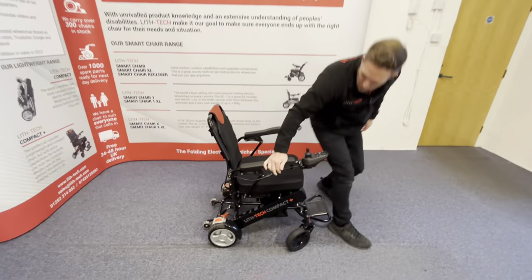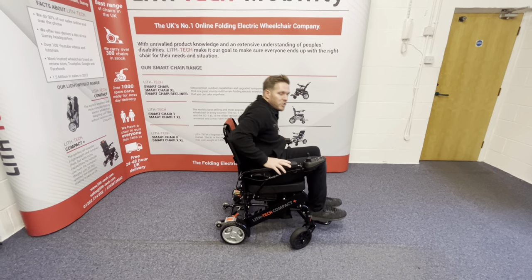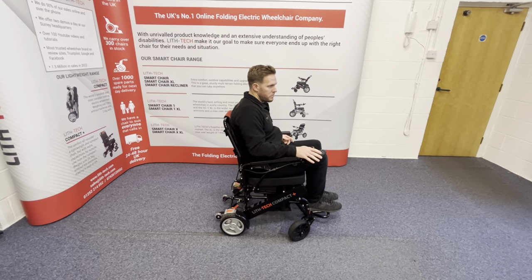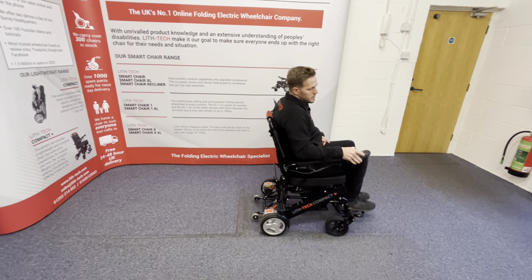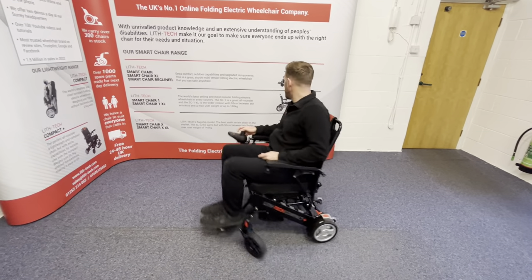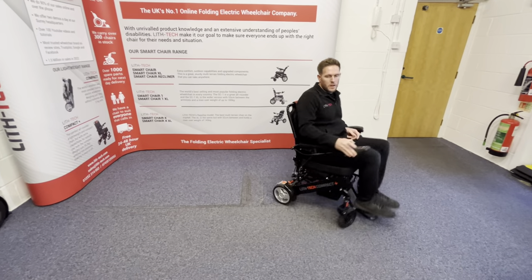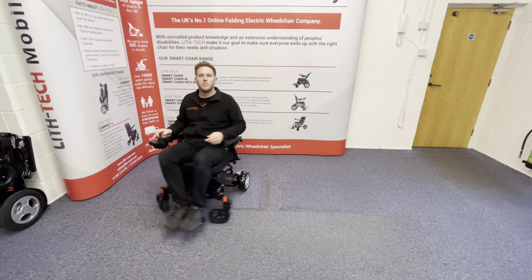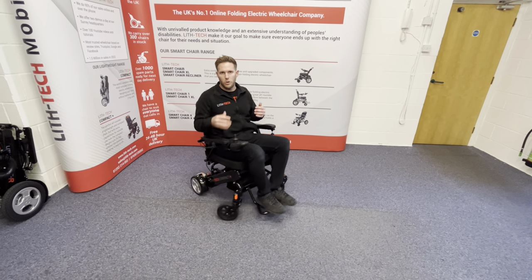Make sure your motor's engaged and the chair's not moving back — that means we're in stationary engaged mode. Turn it on. It's nice and manoeuvrable, which makes it excellent for use in the home, in pubs, restaurants, theatres — places where there's lots of things to potentially hit.